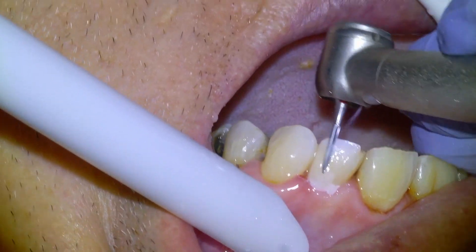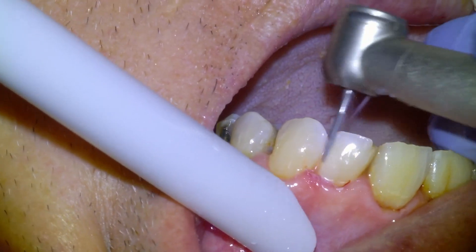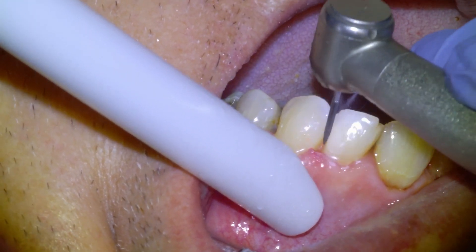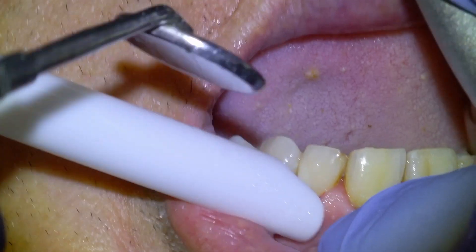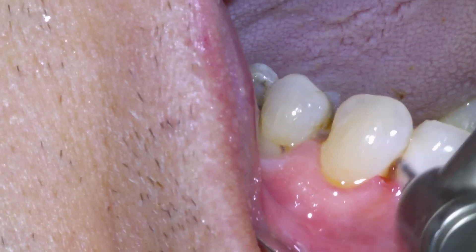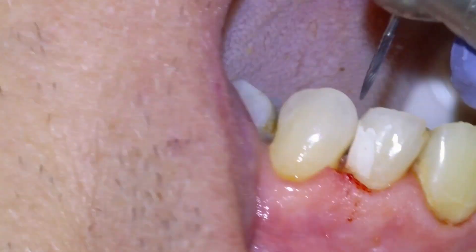Once the material has been cured and set, it's hardened, and we're going to remove all of the excess filling material until we're back to the margin of the tooth as it looked before we started working on it. We're going to do that with this carbide flame burr, and that's basically how a filling is done.